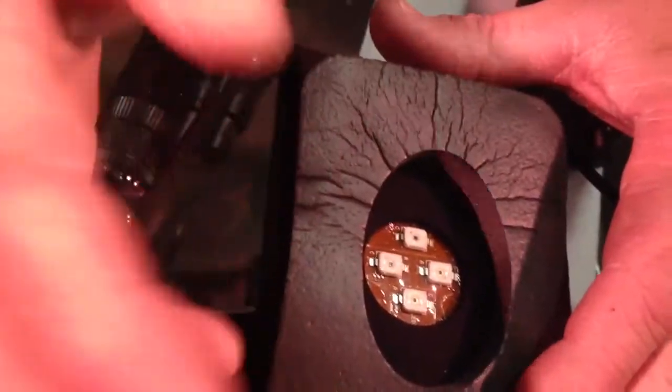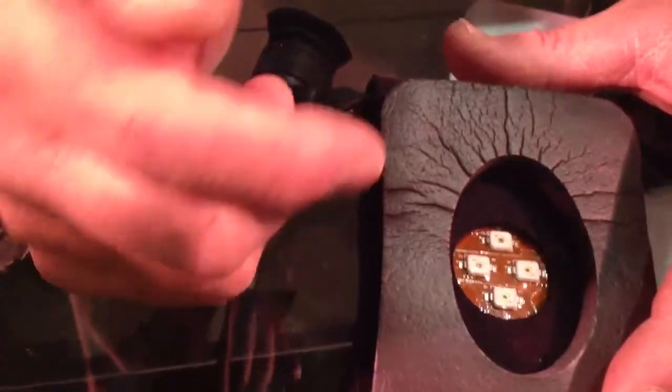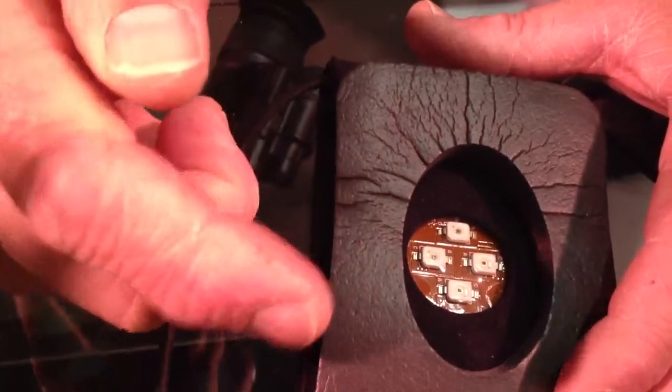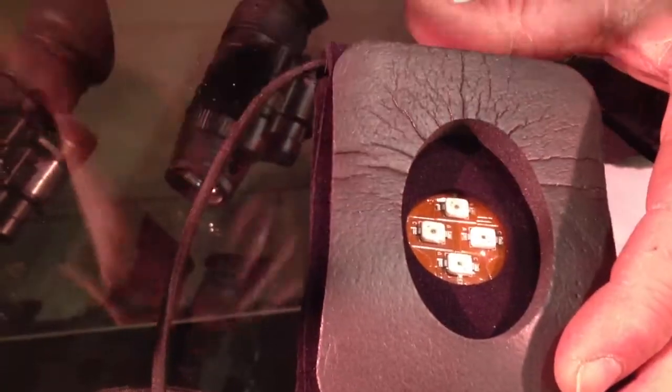It'll do two different things. You can either backside illuminate to get the vessels visible to place an IV, or you can put this distal to your infiltration site and it'll fluoresce the blood in the vein, giving you the ability to still stick an IV in it above the site. This is part of tactical medicine, which is very popular right now.